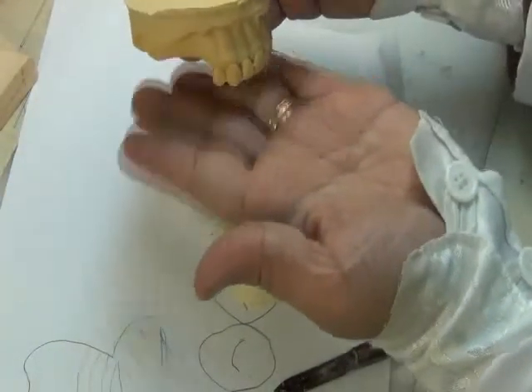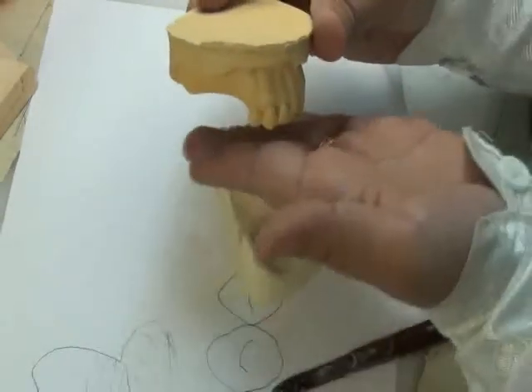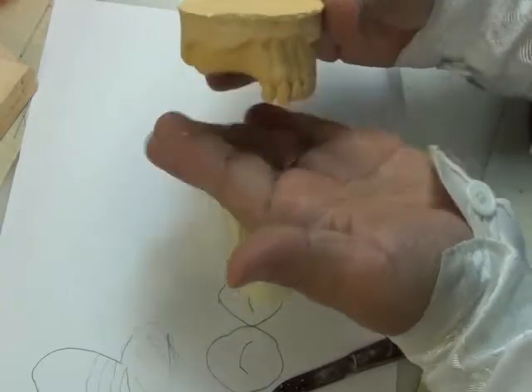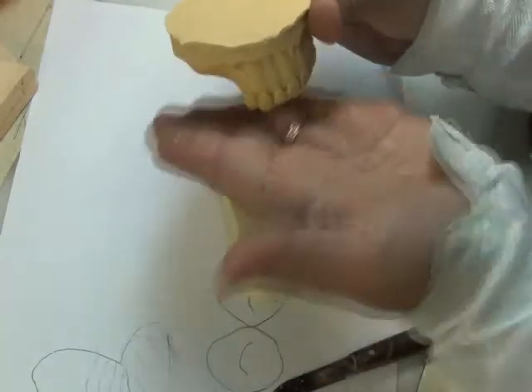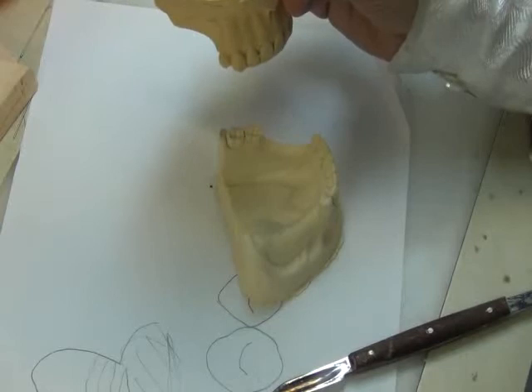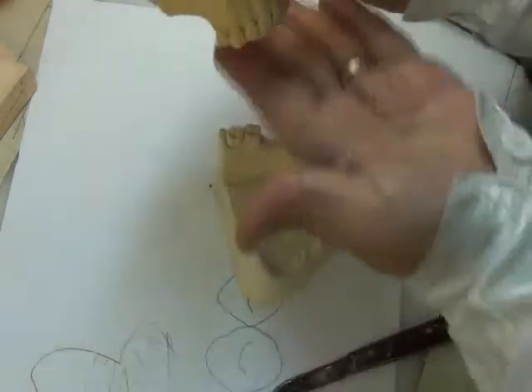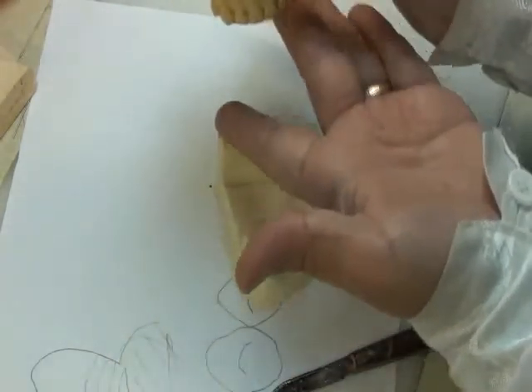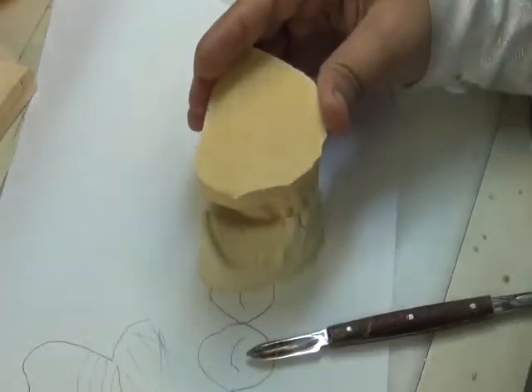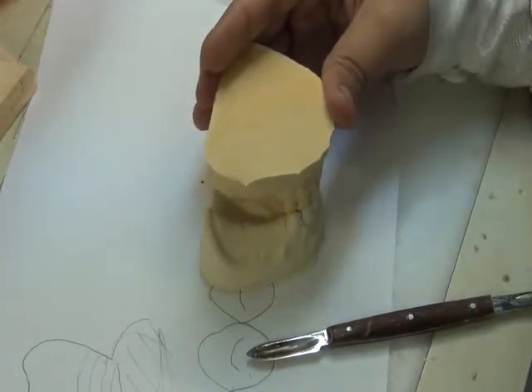I put the Fox plane inside the patient's mouth according to the upper, and trim the upper wax to the Fox plane parallelism. I make sure the interpupillary line is correct, and I make sure that the Fox plane is regular with the face dimensions. Okay, so the Fox plane should be correct with the face. And once the upper is set to the occlusion on the other side, because the Fox plane will be recording the other side here, once this wax is set, I set the lower wax according to the upper wax. Okay? I set the lower according to the upper. So this is an extra step added.